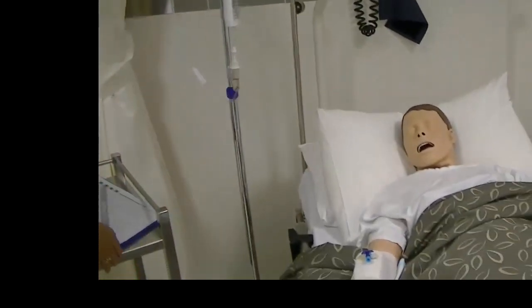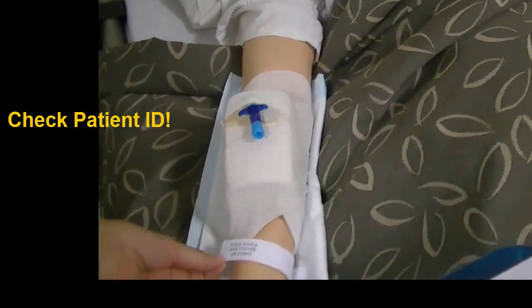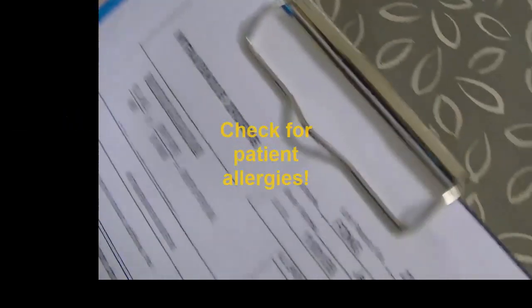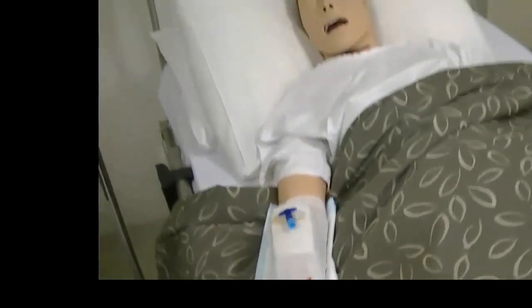Yes. I'm just going to check your ID band with the nurse. So we have Jessica Fong, date of birth 11th of the 1st, 55. You are 233912. Are you allergic to anything, Jessica? Not that I know of. Great. Okay, so now I will connect it up.